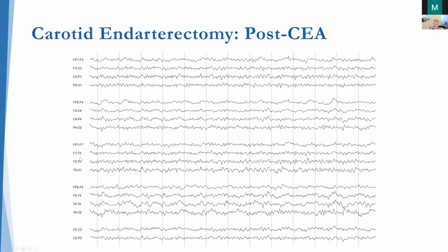When the patient's surgery was done and the patient was being awakened from anesthesia, we can see continuous focal slowing, now delta and theta activity over the right hemisphere, maximal in the right temporal region versus the parasagittal region, whereas the left hemisphere looks fairly normal as this patient is waking up from anesthesia. So this patient suffered an intraoperative stroke, which was detectable using that decrease in beta activity over the right hemisphere intraoperatively. So what would this look like in quantitative EEG?